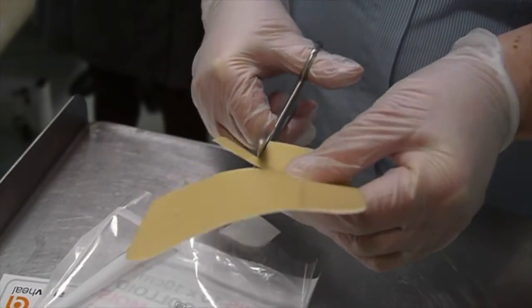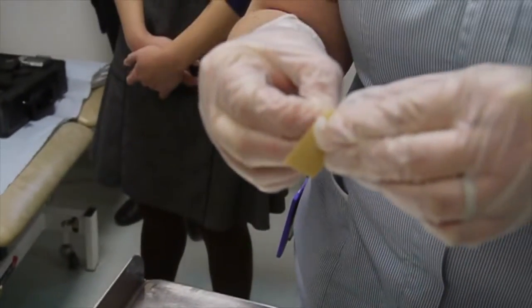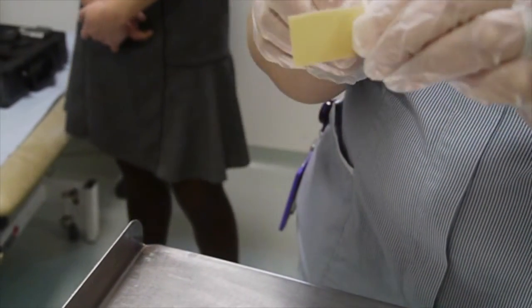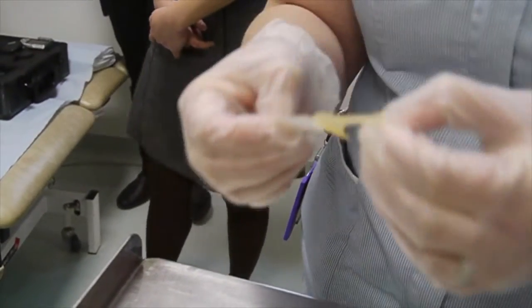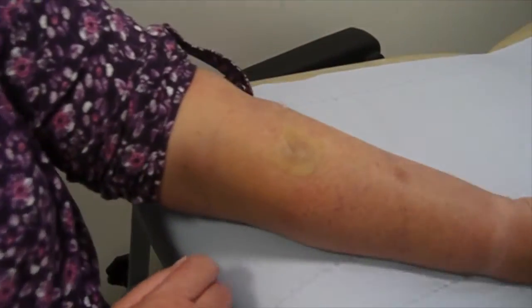A second piece is being cut to cover another patch of eczema. Again the backing paper is peeled off, and now the nurse is going to apply it over another patch of eczema.